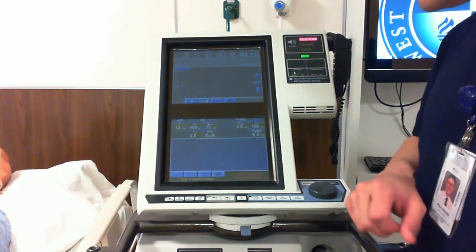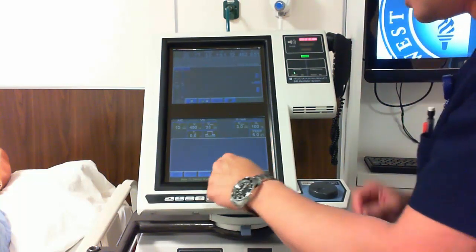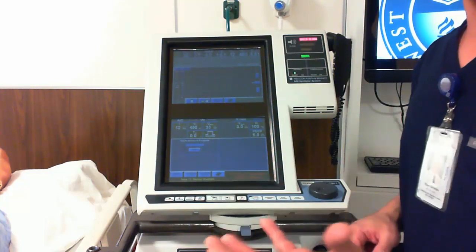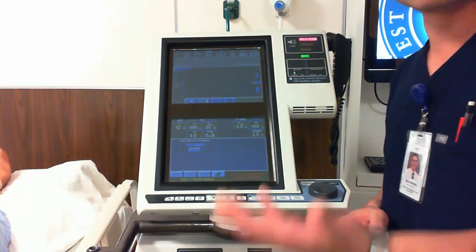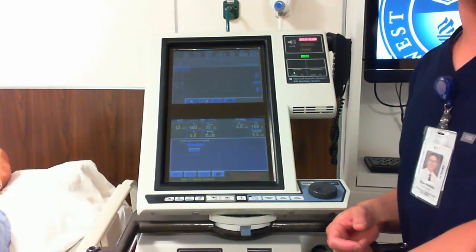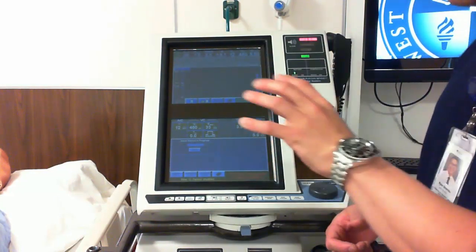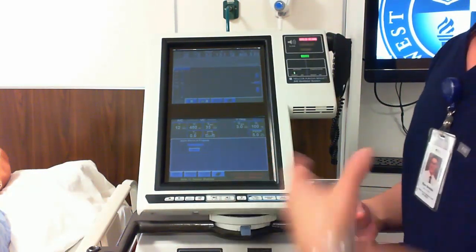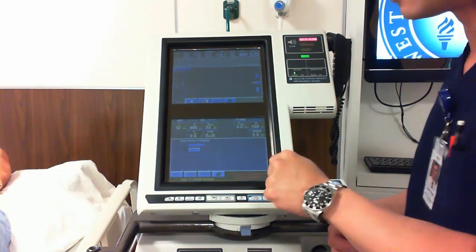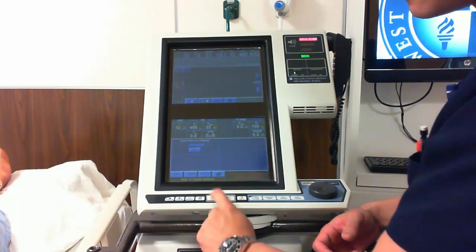All right, so we're going to cancel that now. And the second one is muting the alarm. Again, as students, a reminder, if your hospital says do not touch the alarm and mute those alarms, please follow that practice. Just because as students, we may not know what alarm went off, so to be safe, we just want to make sure that the RN lays eyes on that alarm. All right, so that mute one is here on the left.